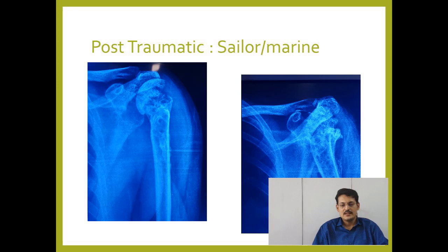On the X-ray there is significant loss of the greater tuberosity and a lot of bone loss. There is overriding of the humeral head, the acromio-humeral distance is reduced, and we can still see the marks of the plates and screws.